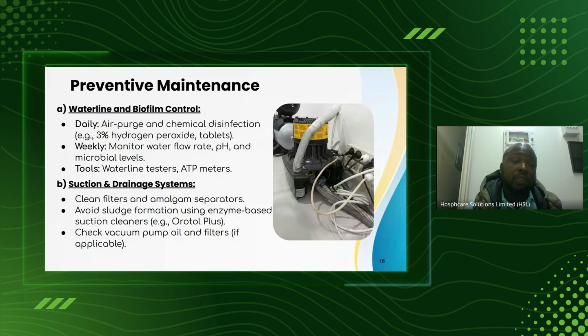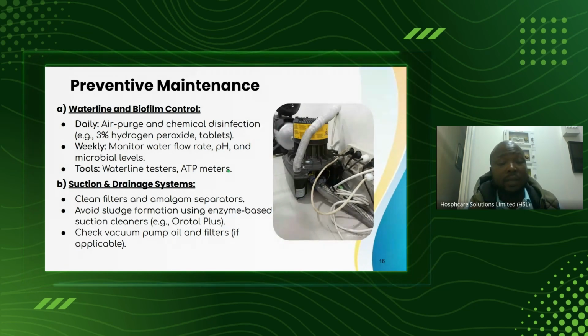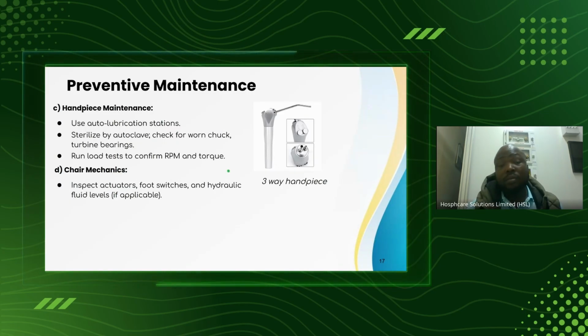In terms of the suction, the effluent, you need to clean the filters and remove the clog from the alginate and composite that are coming from the patient almost daily, depending on the procedure. So this is supposed to be done daily. Yeah, the suction needs to be disinfected. We have various types of disinfectant used in disinfecting the suction line. I have given an example here, the Orotol Plus, and many more.